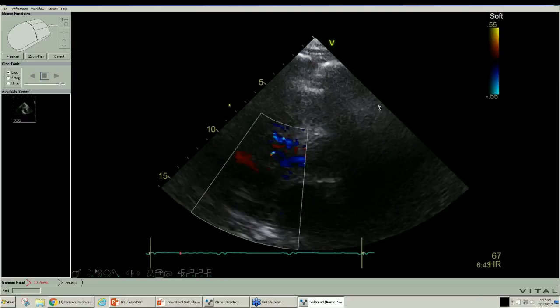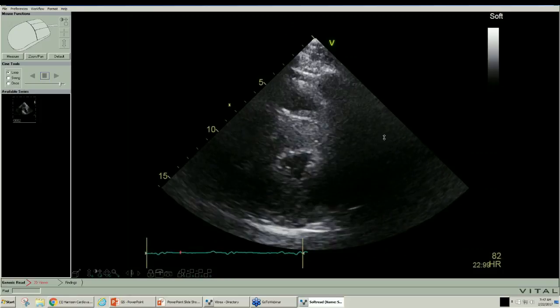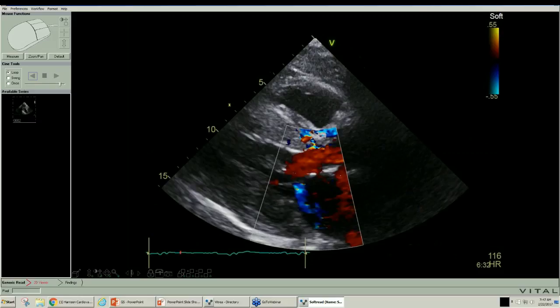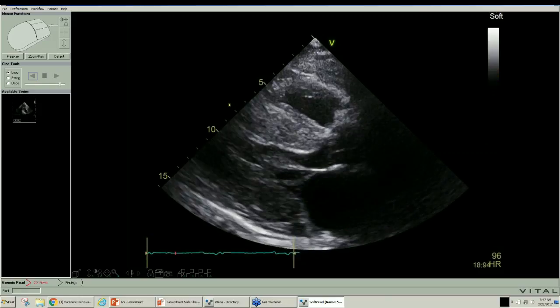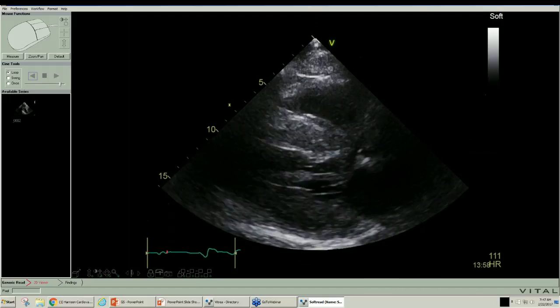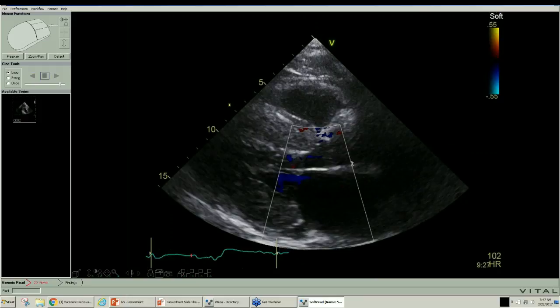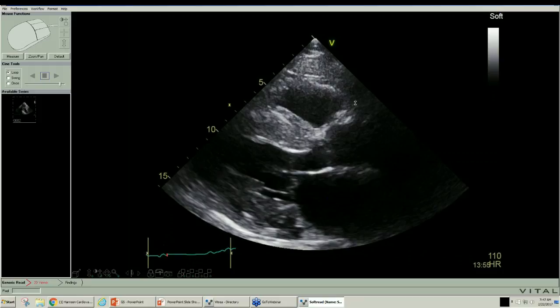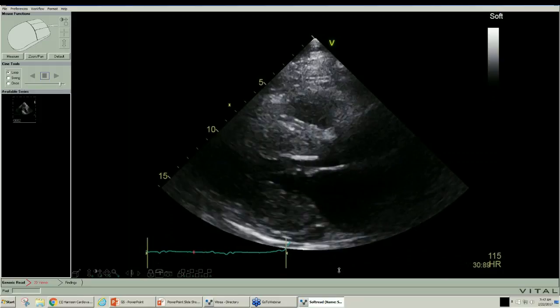Let's roll through this a little bit. Aortic valve, right-sided pressures, left-sided mitral regurgitation, left atrium. Contractility, there's not a lot of room here. Here's the mitral regurg, still minimal. Certainly not hypertrophic cardiomyopathy. It looks funny. It looks kind of speckled. Doesn't look exactly the way everybody looks. So there is some tissue interrogation that's involved in looking at the walls, and it doesn't look right.